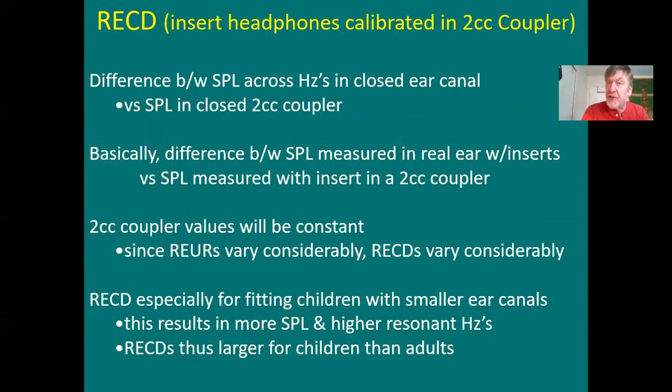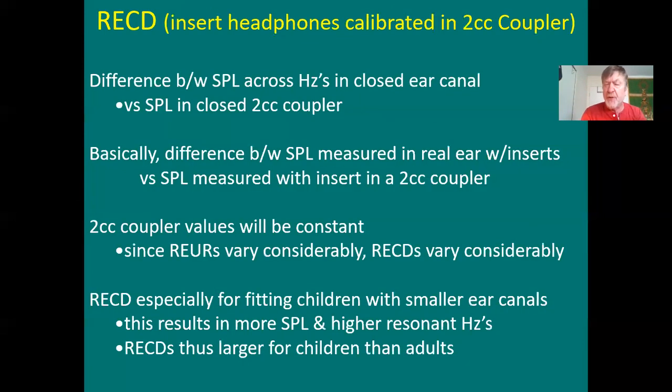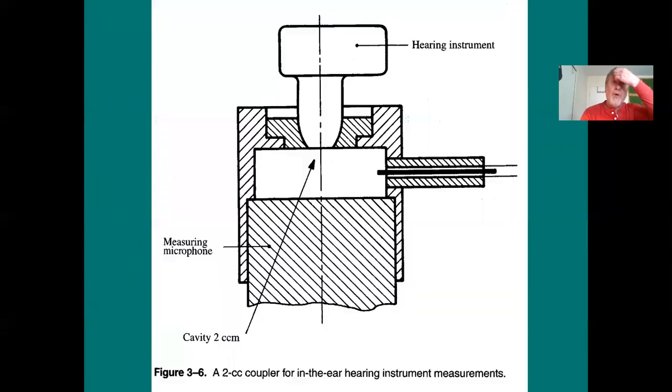But real ear to coupler differences, if you measured them, would all hover around this. They would all be similar to that, but they would all be just a little bit different, if you measured them. And this is basically how people measure it.